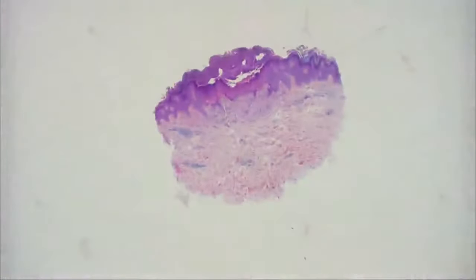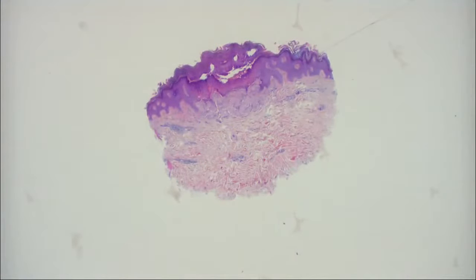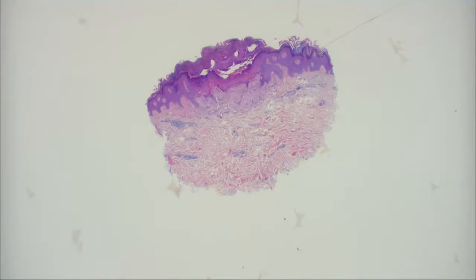Alright, so we have a punch biopsy. So far what you can appreciate is that there's hyperkeratosis with orthokeratosis, most likely. And then there's what appears to be a superficial, slight inflammatory infiltrate. Yeah, it's pretty sparse. You said there's hyperkeratosis and some papillation here. This is more papillomatosis, as opposed to digitated hyperplasia. Yeah.